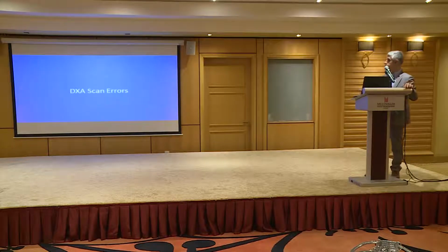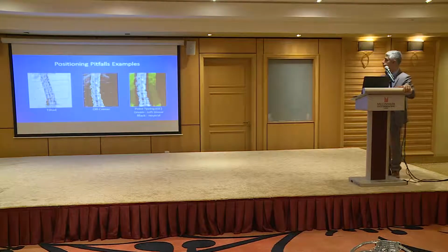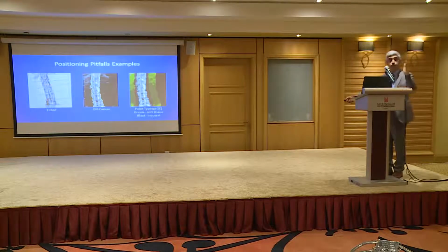DEXA scan, these are just images. We'll go through them, and we'll see what the error is here. So a positioning pitfall. This is tilted. We'd like them to be non-tilted so we can have a better view.